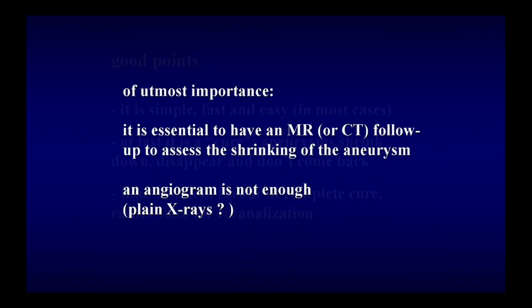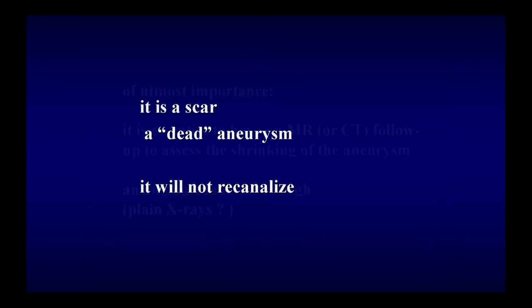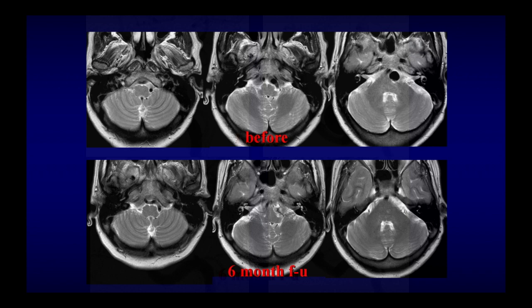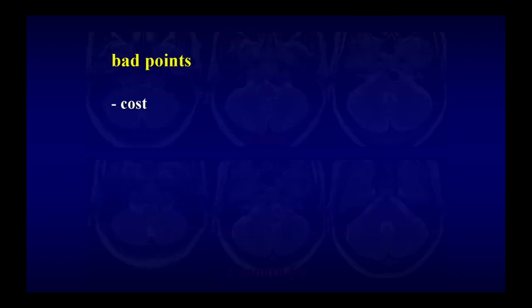And as you've seen, this is something that I've shown you in the tutorial, so I will not show it to you. Except this one, probably it was not in the tutorial. So this is the beauty. You have a large aneurysm, you put a flow diverter, and it's gone. And the PICA, which was coming from the aneurysm, is still there. So it's an intelligent device. It occludes what's to be occluded, and it stays open what has to stay open. And this is, of course, the complete disappearance of the aneurysm. We have already seen this.